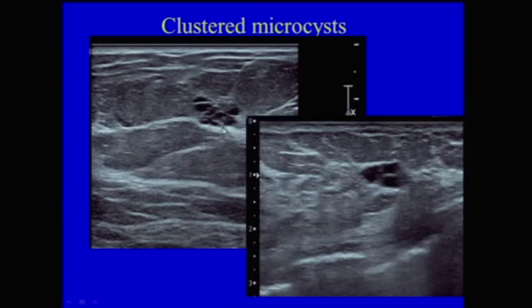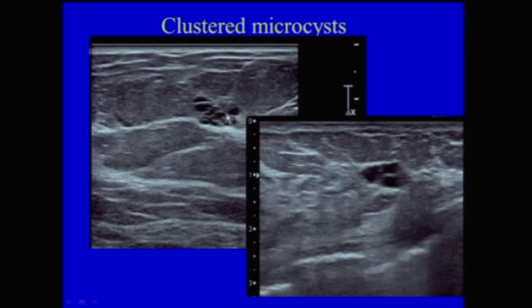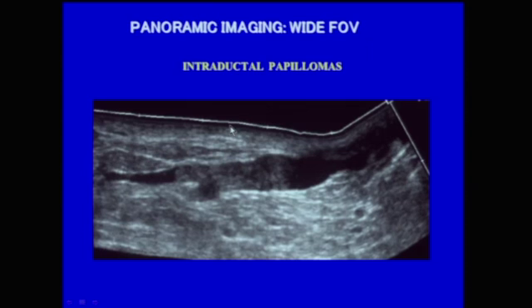Here's an example of clustered microcysts in perpendicular projections — a mass with multiple tiny cysts with thin septations and no solid components. It's very important to evaluate these carefully; if you see a solid component, biopsy is probably indicated. If there are only thin septations and no solid component, these are benign and don't need to be followed. For intraductal masses, panoramic imaging with wide field of view helped show the extent of this intraductal mass, which was a papilloma.